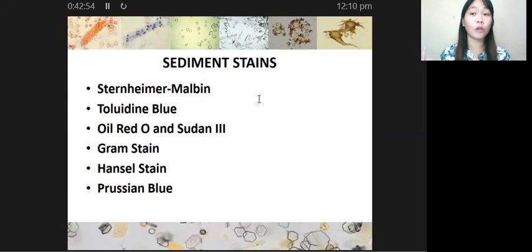Ano ang specimen natin? We have your 12-hour urine, and then the preservative that is utilized is your formalin or your formaldehyde. Okay, and we are merely looking at certain populations or certain types of sediments. So if these sediments are present in your urine, then it indicates renal disease. In particular, if the number of your RBCs is greater than 500,000, then renal disease. Ibig sabihin, WBCs and your epithelial cells, if they are present greater than 2 million, that's in your Strasinger.